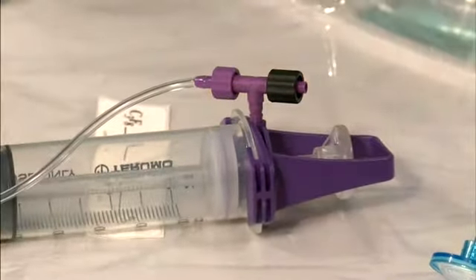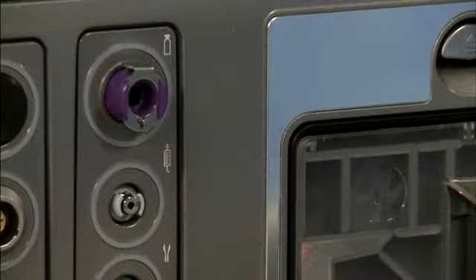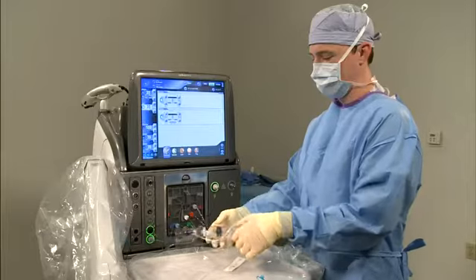Note the plunger will not be completely depressed. This position is correct. The auto gas fill is now ready for connection to the auto gas fill port on the console. The port on the console is color-coded for ease of identification. The flange on the connector acts as a sterile barrier, so this task can be performed by the sterile scrub nurse.